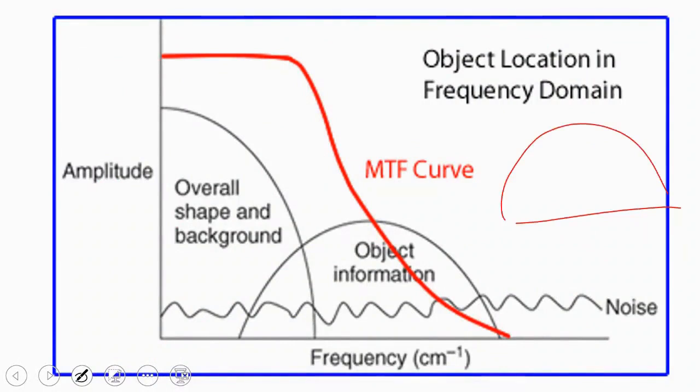The signal that comes to you is that if I have an object that contains radioactive material and emits a signal, there is a part that I call the background. The background always gives you low frequency. So you will find that its frequency is always low. The object with the highest activity falls in between low frequency and high frequency. So what does high frequency represent? What comes to you in high frequency? The noise. There is noise.